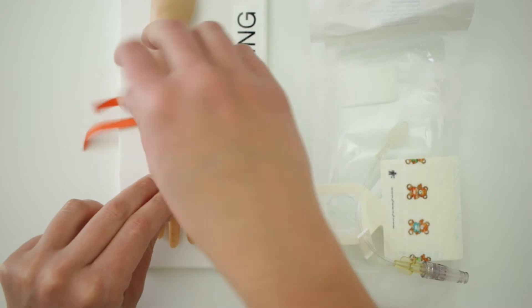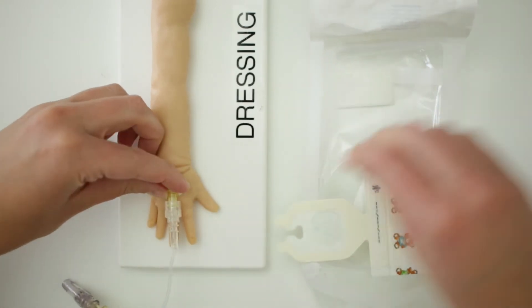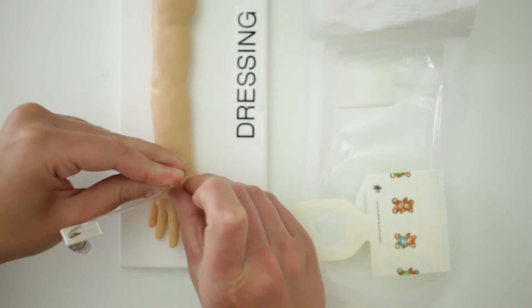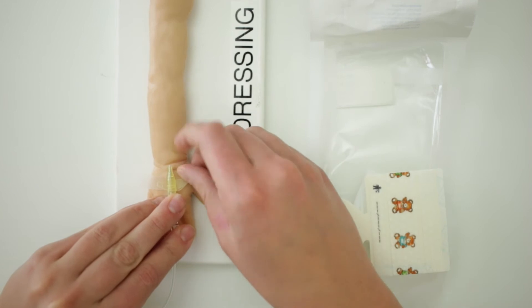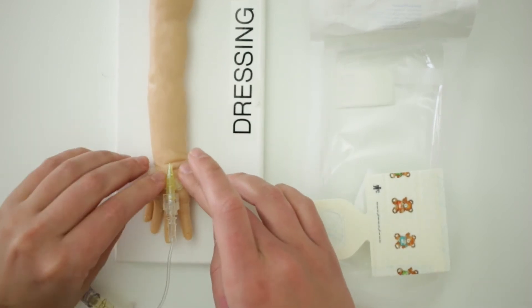At this point, we are ready to actually start taping our PIV. It's important to grab another set of hands when doing this — especially with little guys, you can't tell them to hold still. To set yourself up for success and make sure you don't lose your IV in the process of taping, grab another person to hand you pieces of tape and make sure the patient doesn't wiggle. This video is just about taping, and we are going to assume the IV has been successfully placed into the vein. I've connected my primed extension piece with the microclave on the end. I'm going to go ahead and put a small piece of the prepped sterile tape underneath the wings of the IV and fold them forward, sticky side down on the skin, to provide a little bit of extra stability.